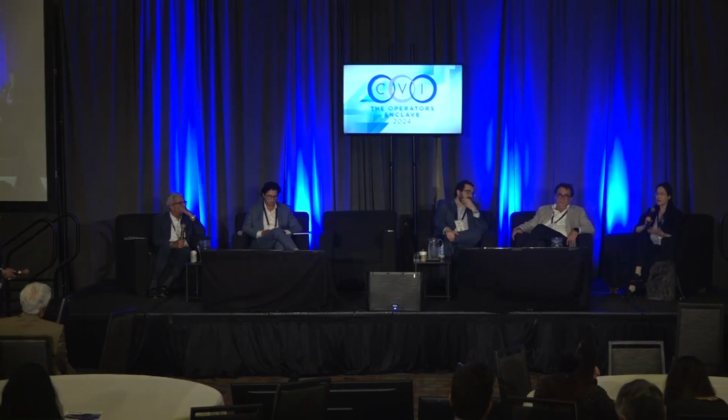If for your particular center, anesthesia is not an issue, getting imaging is not an issue, I do think TE gives you better images and is less technically taxing for the interventionalist. If those logistical issues become a problem, then yes, I think 3D ICE gives you an excellent option. And then, of course, there are also going to be patient characteristics, if anatomically they can't pass the probe.